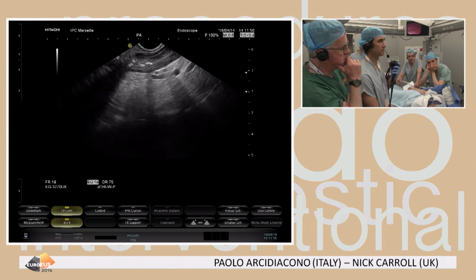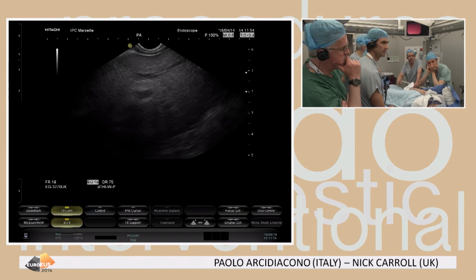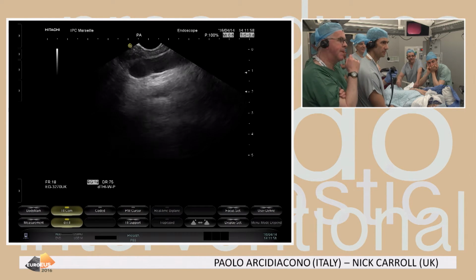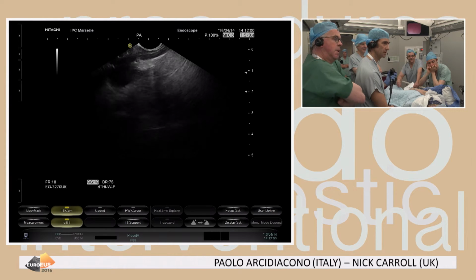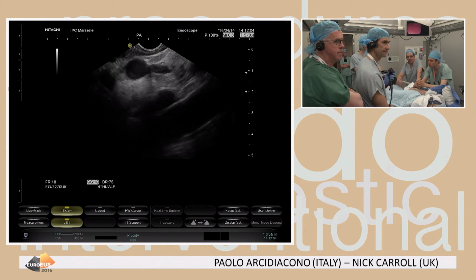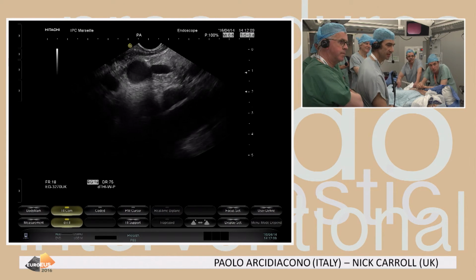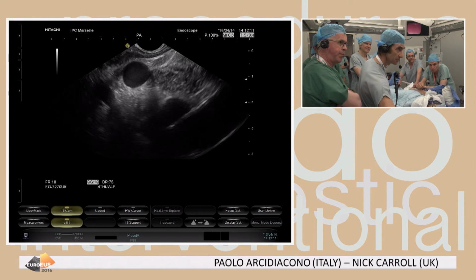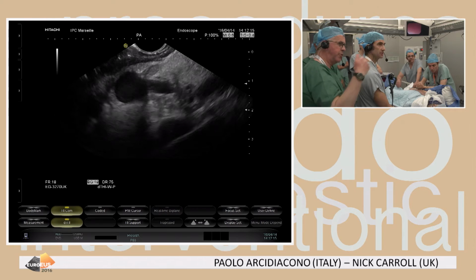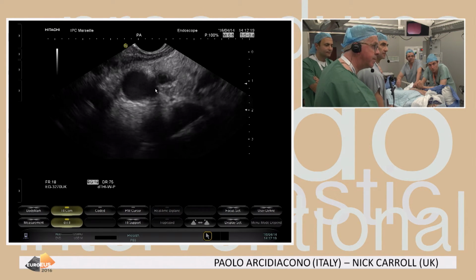But the problem is a total pancreatectomy. This is the comorbidity that we will induce. Yes, this is the main problem. We have to be sure there's no neoplastic tissue. No, we don't see any. But the first time also we didn't clearly see it from the stomach. So the surgical margin, you see right on the margin, around the surgical margins here.